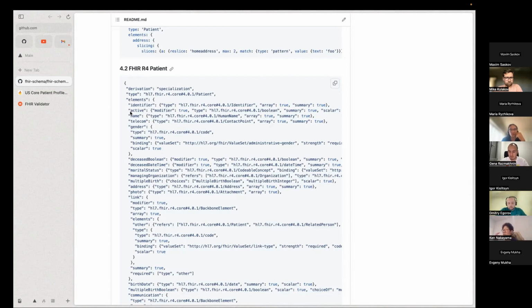Another challenge was to implement FHIR validation without snapshotting, because for now the logic of FHIR validation is split into two parts. It creates a snapshot, and a lot of logic handles creating the snapshot and then running the validator. But the creation of the snapshot brings a lot of problems. First of all, you should distribute your resources with the snapshots.